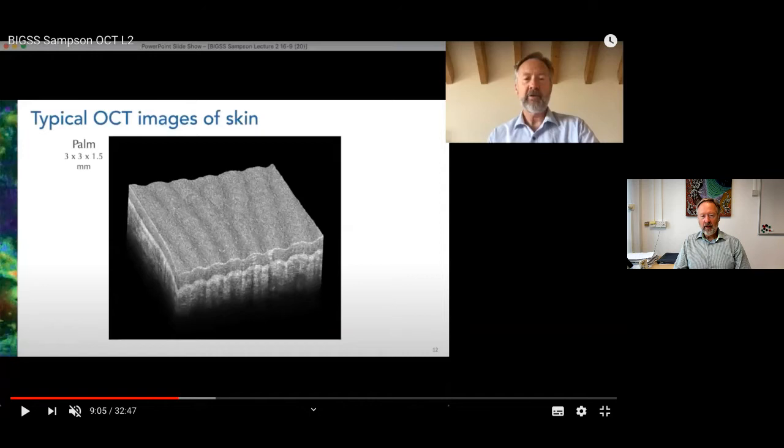While you mentioned the scale bar, this is a bit of a bugbear in OCT generally, and more so, I think, on the biological side. I think L-shaped scale bars are really useful because quite often OCT images don't have the scale in X and Y, and we need to really encourage everybody to use those. You give the scale on the left-hand side anyway, so the information is there. But it's really important that people put that information in because ultimately most of us are physicists and engineers and we just need to know the dimensions, right? Rule number one, completely agree, Martin. How many times do I look at images where I don't see the scale bars? It's absolutely unforgivable. And we do ourselves a disservice as a community if we don't adopt a level of professionalism when it comes to presenting our data.